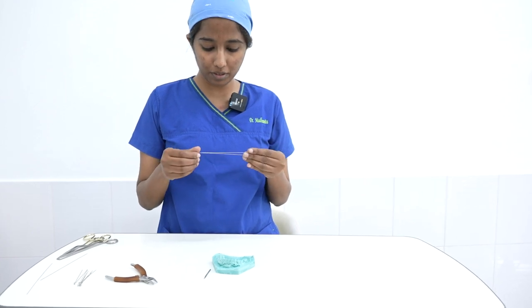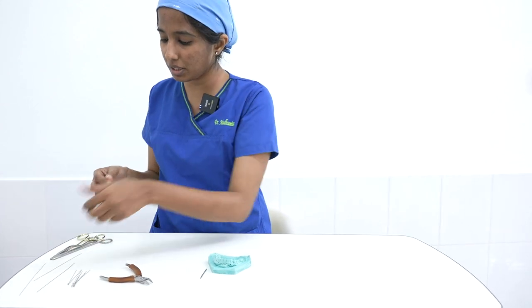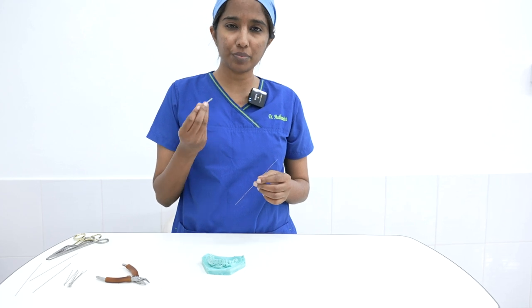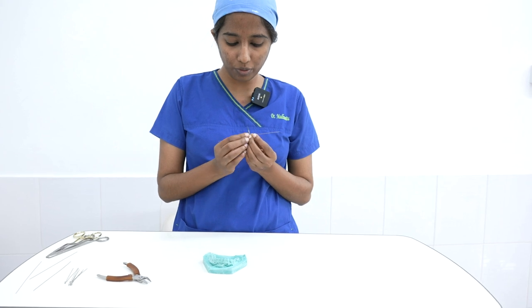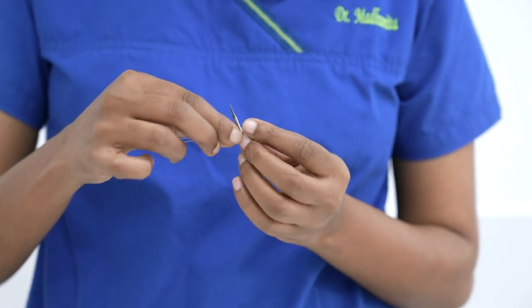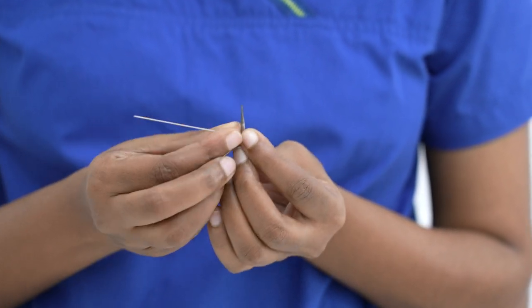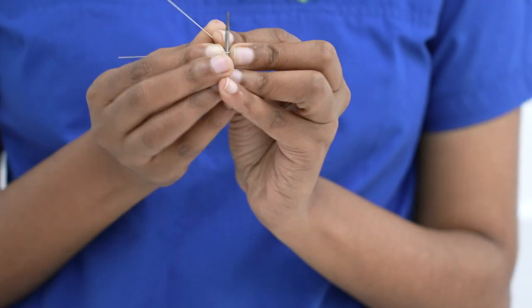Now we have two equally cut pieces of wire, about 15 centimeters each. Next, you take a burr or a probe and wind the wire around the shaft of the burr. We are going to do two loops, so I am going to take it again for the second time over the first one.